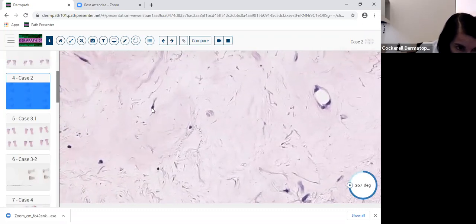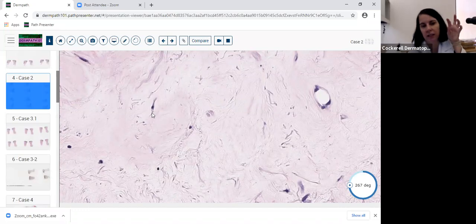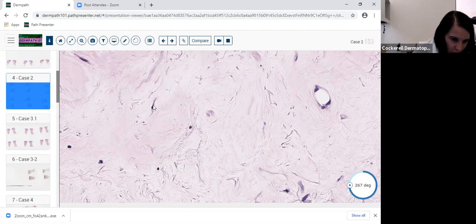When you have a bizarre fibroblast, you're gonna see intranuclear vacuoles, you're gonna see a large nucleus, much larger than normal for a fibroblast, and it'll have some intranuclear inclusions and vacuoles and be irregular, but it won't be high enough N:C ratio to look malignant, because the cytoplasm grows with the size of the nucleus. So those bizarre fibroblasts, you have to look for those, and that'll tell you it's radiation. And radiation can look very sclerotic. So radiation is a mimicker.